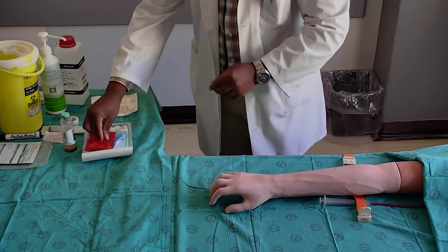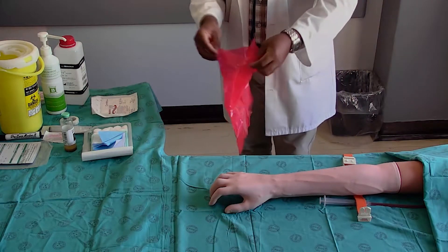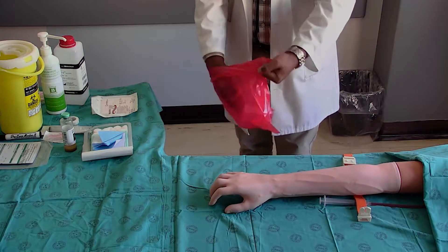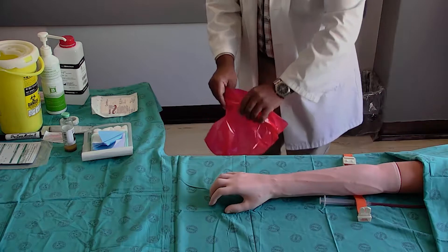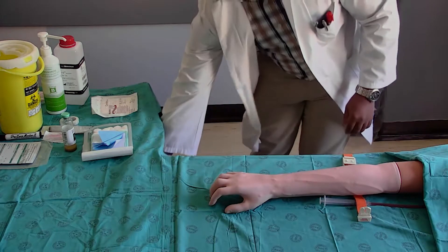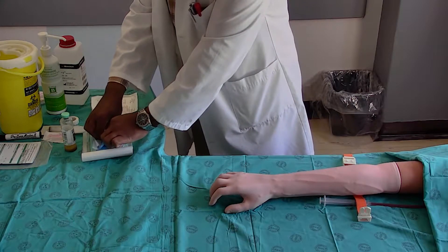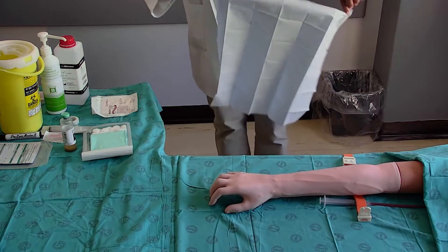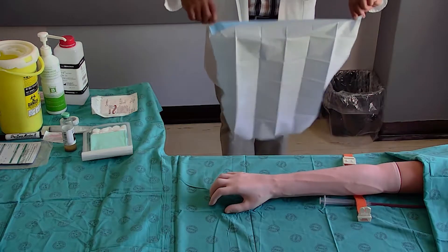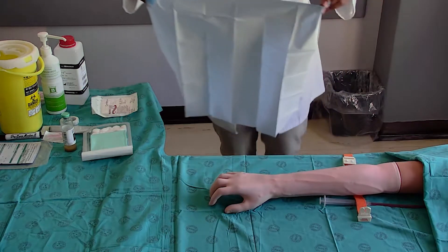Remove the red waste bag, open it and place it facing towards yourself. Remove the blue sterile field by carefully holding the corners — do not let it touch the surrounding areas. Place it onto the trolley or next to the patient's arm, not under the arm. The side you touched during the unfolding should face down.